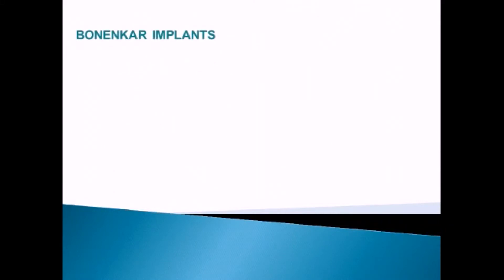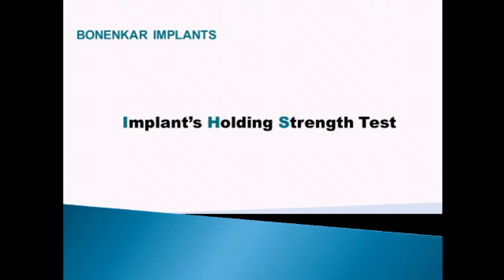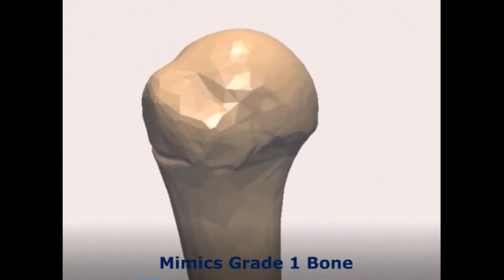Bonenkar implants holding strength test is an important factor to determine implant initial stability. We also compare our implants' initial stability with other implants in bone simulation models. The material of choice for the bone simulation is solid foam.